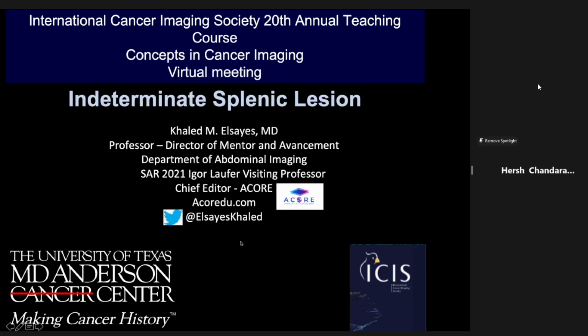It's very difficult to speak after Dr. Hirsch and Dr. Murana and Dr. Sadaf. They are great speakers and I enjoyed their talks. Thank you very much, Dr. Sadaf, for describing my lecture as elusive, because it is.